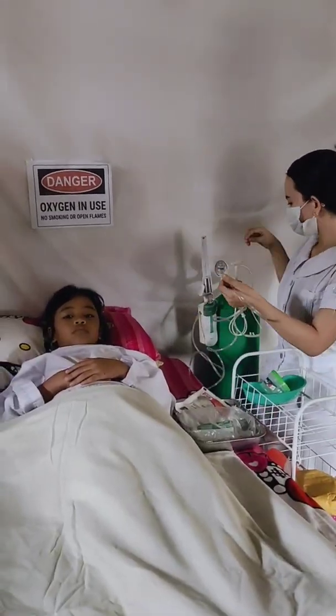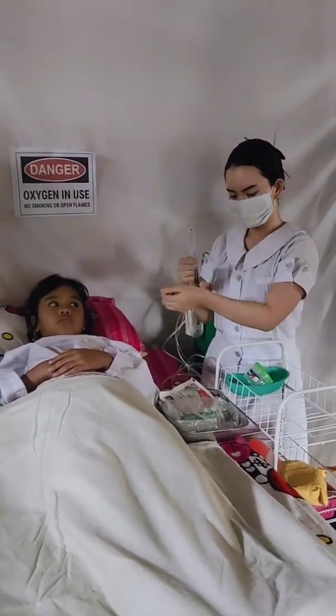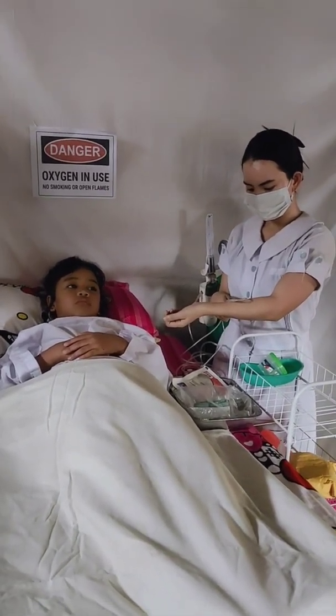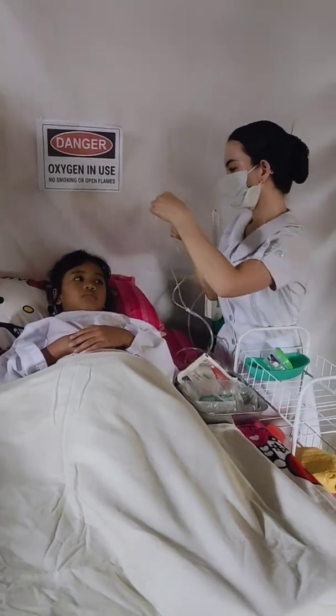Next is turn on oxygen at the prescribed rate and ensure proper functioning by using the posterior aspect of the forearm to feel oxygen released from the tubing. Prescribed rate is 3 liters per minute. Oxygen must be administered as prescribed.